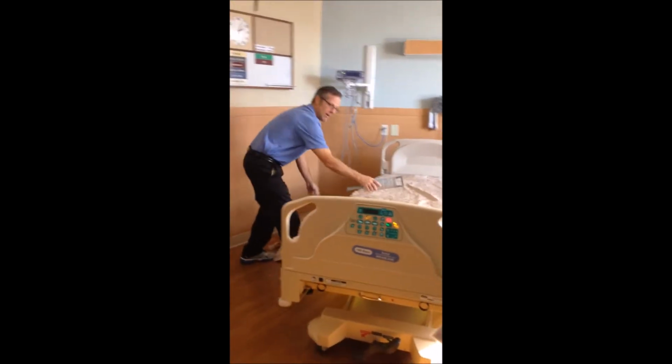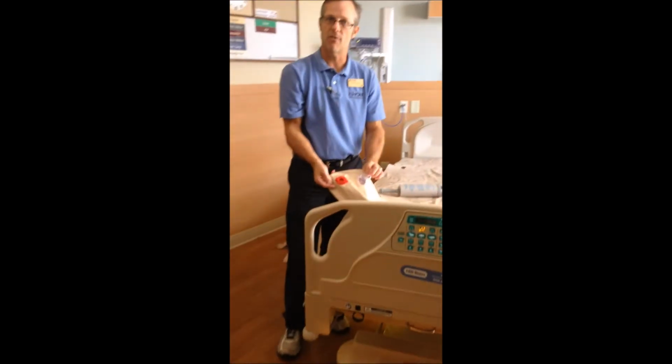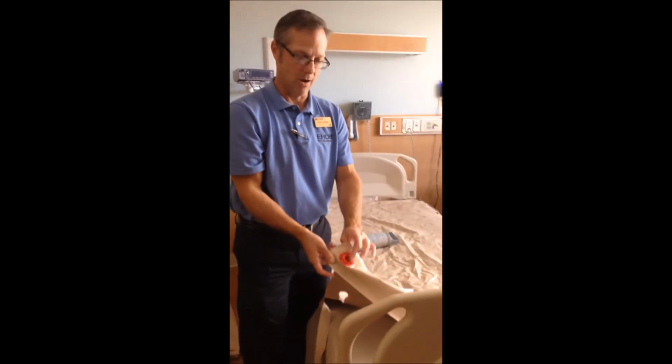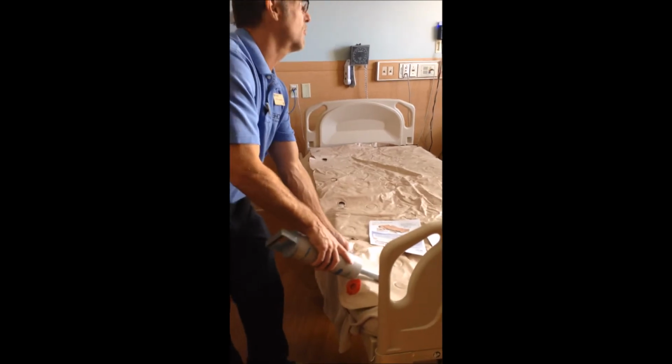What you're going to do is roll it out on the bed, just how I have it here, and there are valves over here. You might be able to see this a little bit better. These valves right here will go at the foot of the bed. There's a red valve and a clear valve. Red is for rapid deflation. Where you want to inflate it is the clear valve. And it says right here, if you forget, 42 strokes of air.